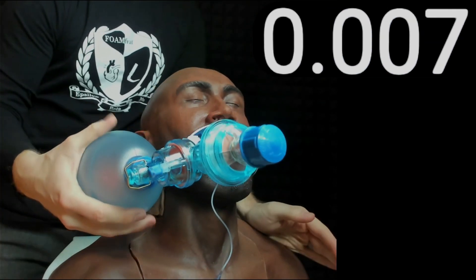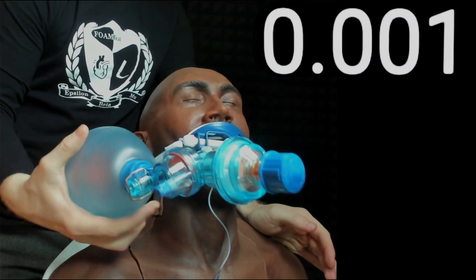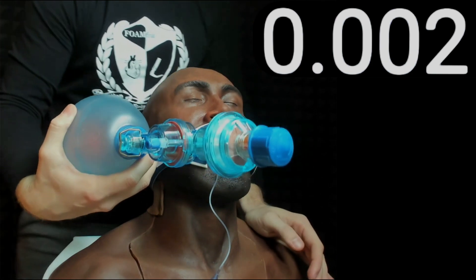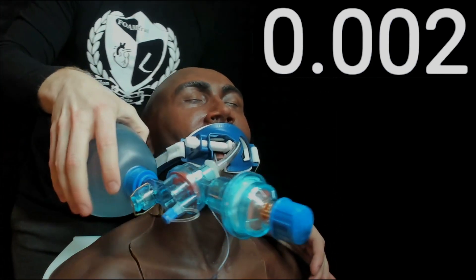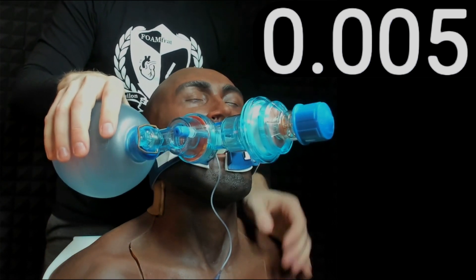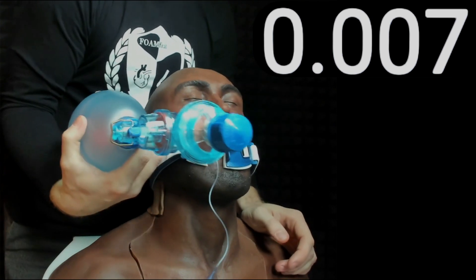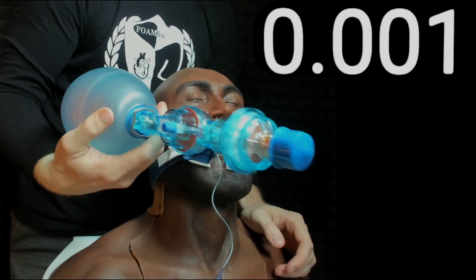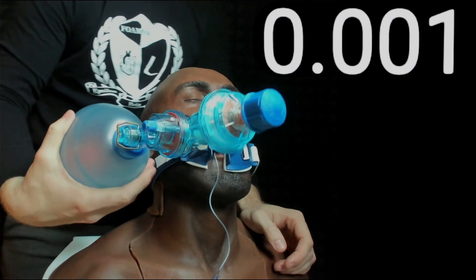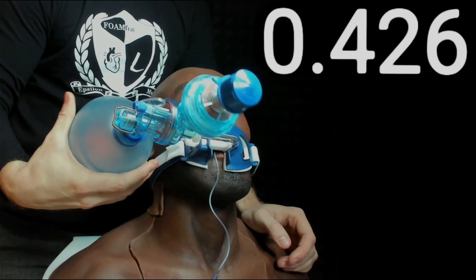Now I've got an adult small bag valve mask. By the way, I always like to keep my hand underneath — I don't feel it's safe to use one of those hand straps, especially if you have small hands. I always think about holding it as if I were pulling a football into my arm. I'm going to get my fingers touching in the middle and see what that number is.